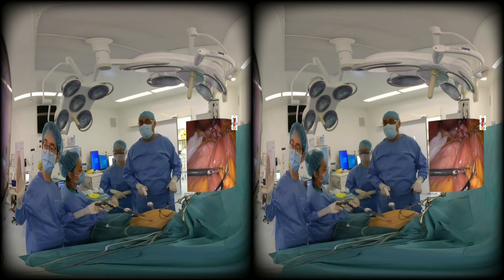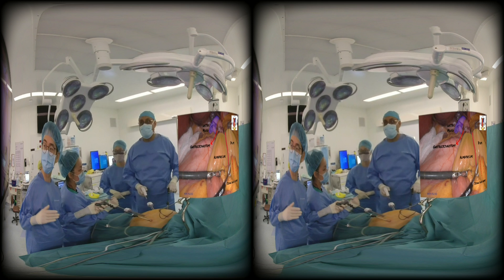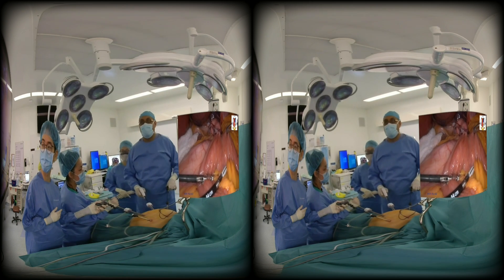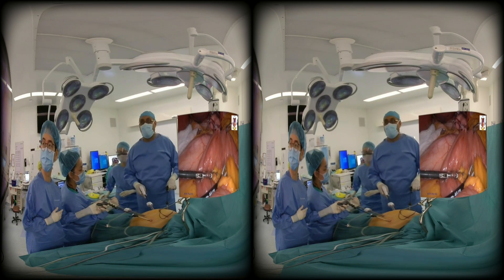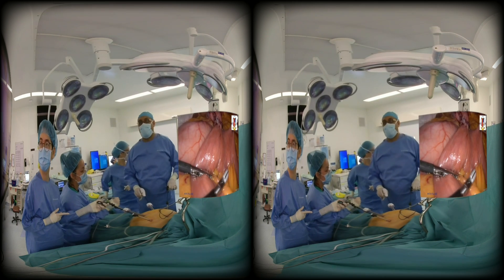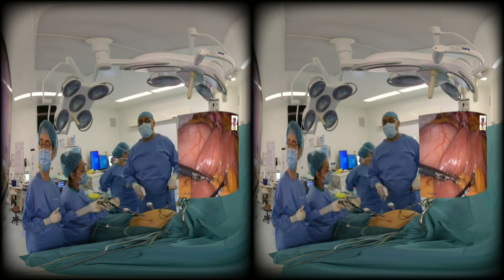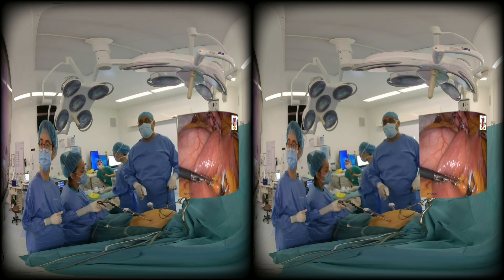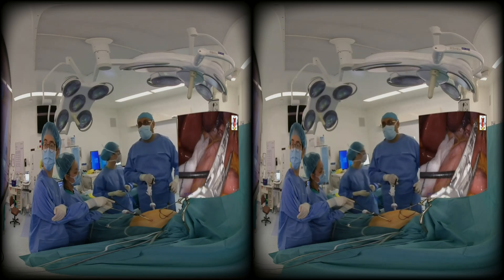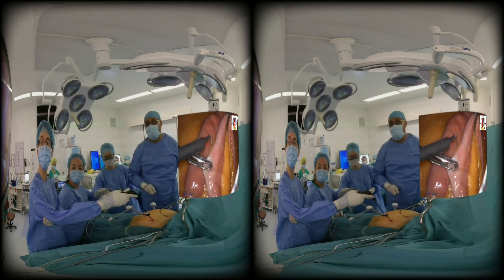Here you can see in the diagram the gastrojejunostomy, the alimentary limb, the BP limb, and the direction of jejunal blood vessels. You cut along the line in order to prevent any injury to the jejunal vessels, keeping the entire loop vascularized. A mesenteric defect is created just next to the small jejunum. Once you go to the other side, it is dilated, and I use a vascular reload to transect the small bowel. Once you have measured up to 100 centimeters, the common channel or distal bowel is in the hand of the assistant.